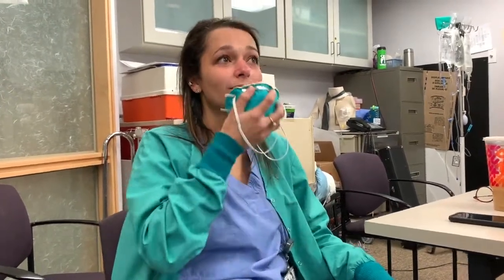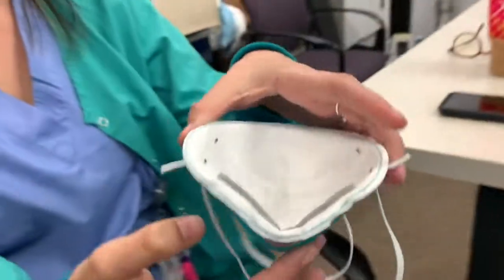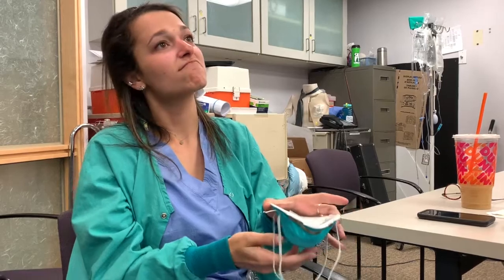We're going to talk about performing a seal check on your N95 mask. This is not the same as a fit test — it's just a seal check. Pay attention to Emily. Put your mask on first and inspect it: make sure there are no tears, the integrity is good, and it's not soiled anywhere.